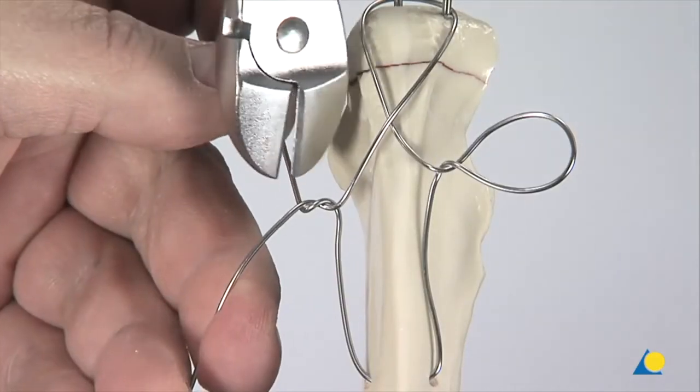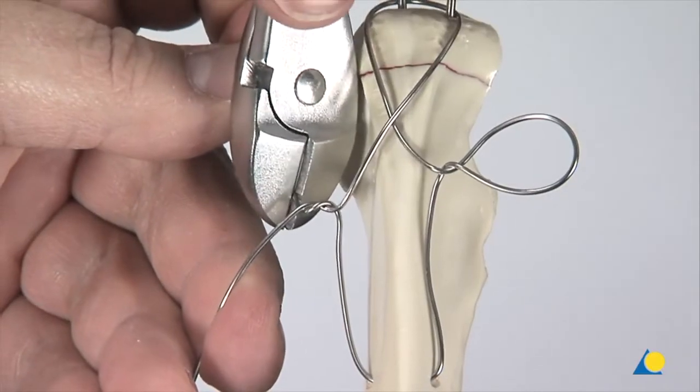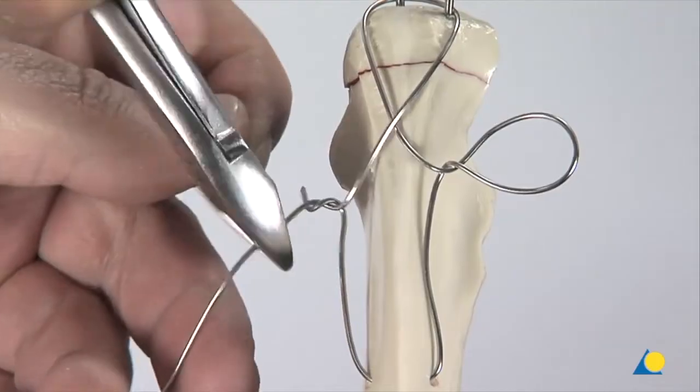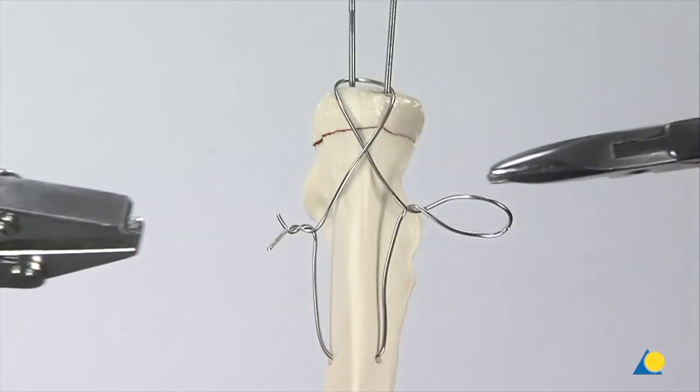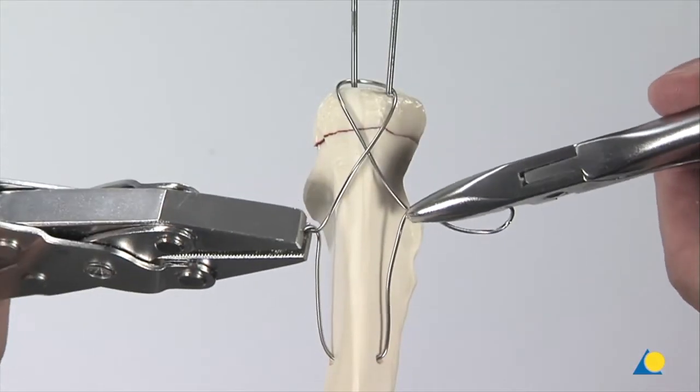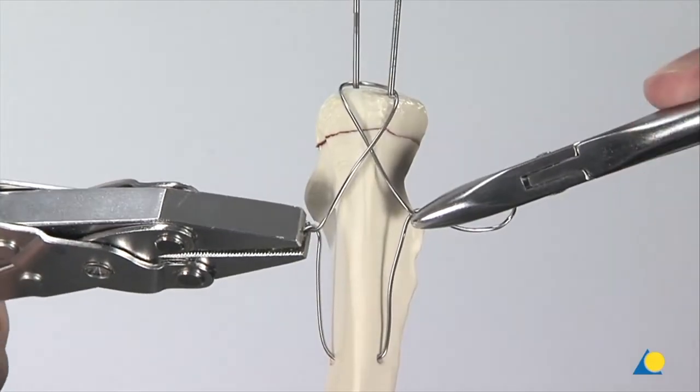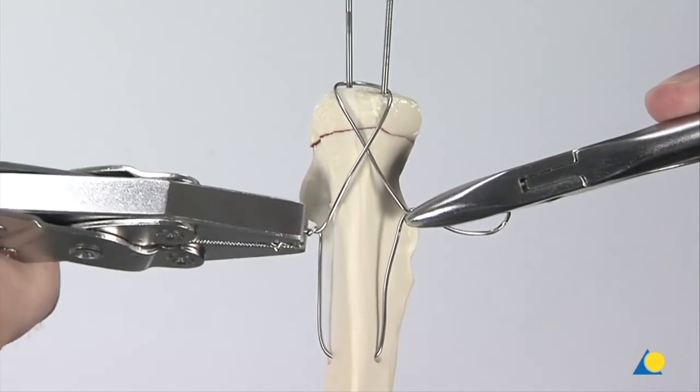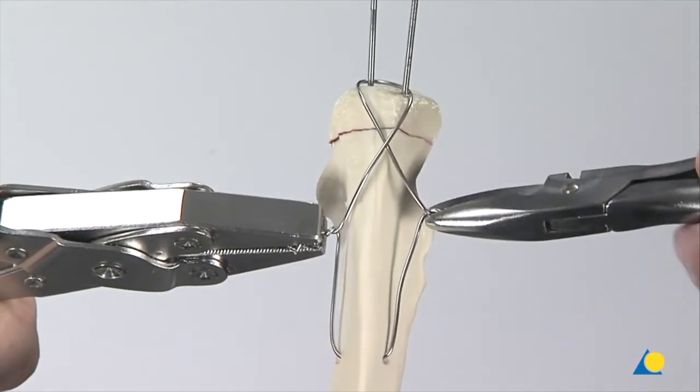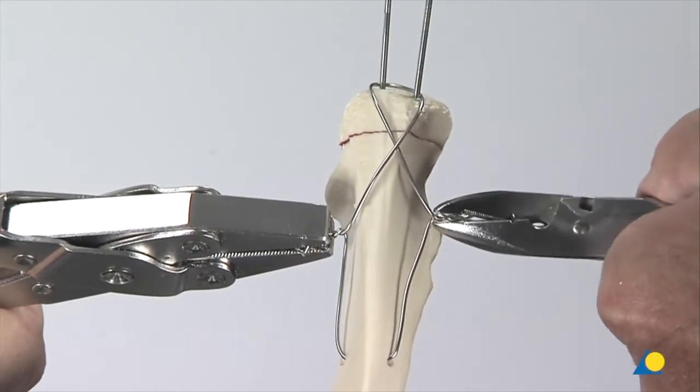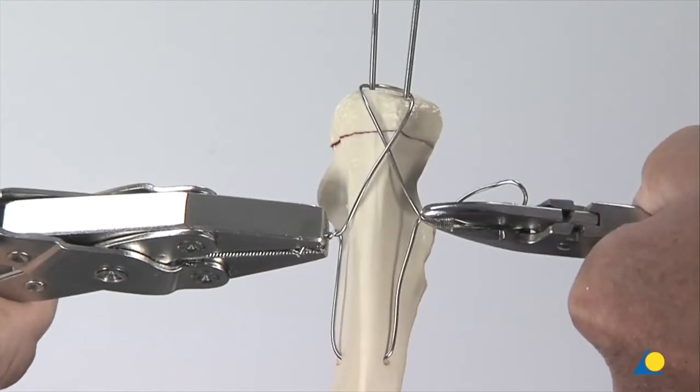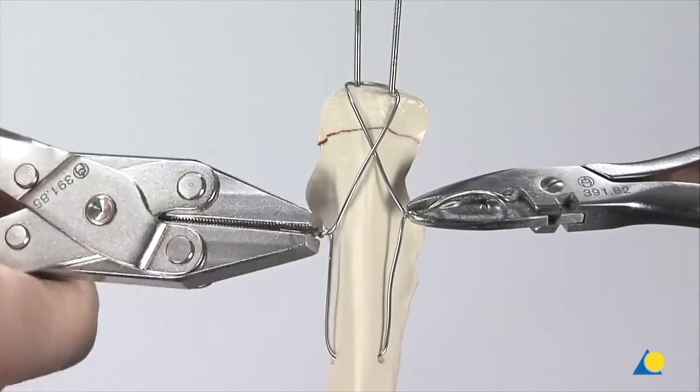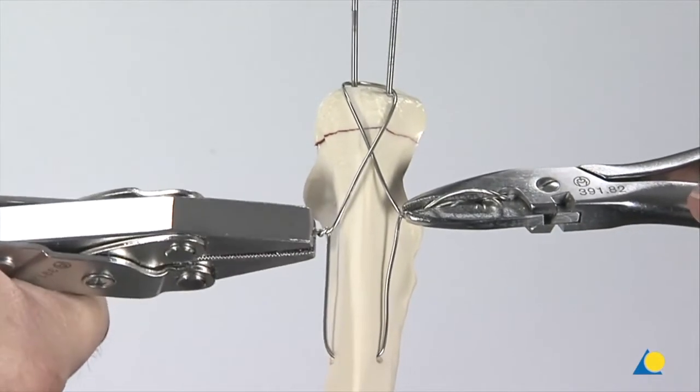The ends of the wires are trimmed with the wire cutters. To tighten the wire, the flat-nosed parallel pliers and the wire bending pliers are used. The wires are pulled and twisted at the same time. To ensure that tension is applied equally, this procedure is repeated alternately on either side of the bone. The wires should be twisted a minimum of 4 times.